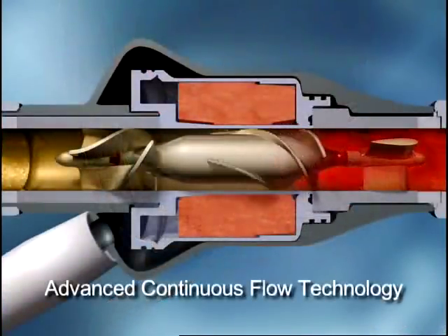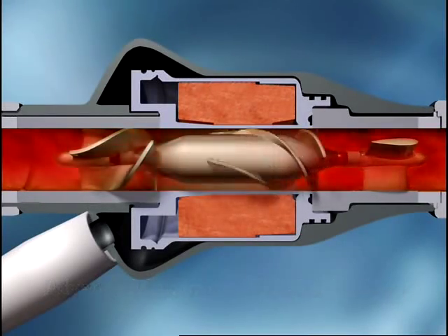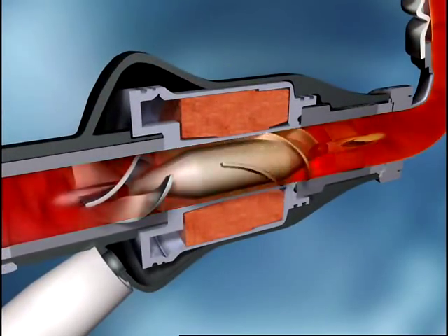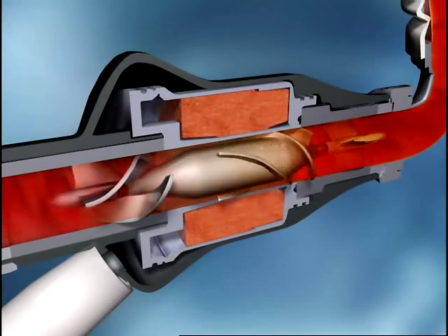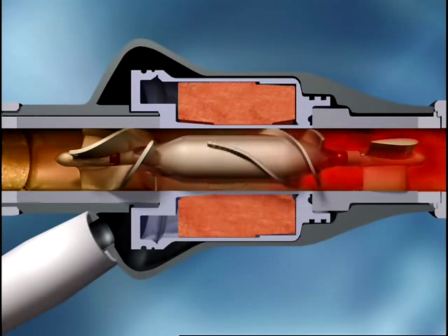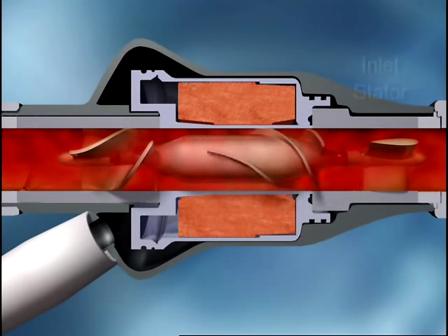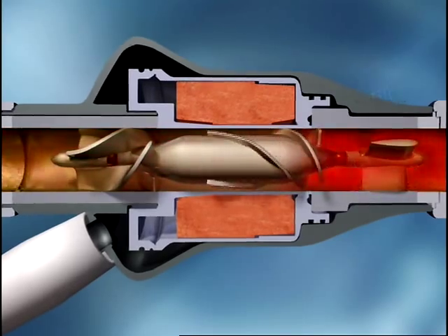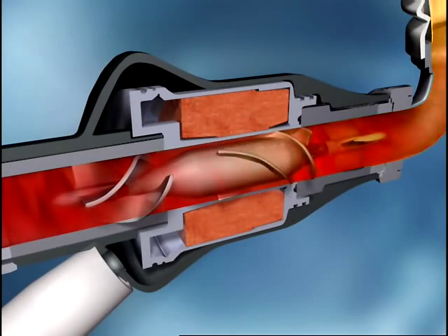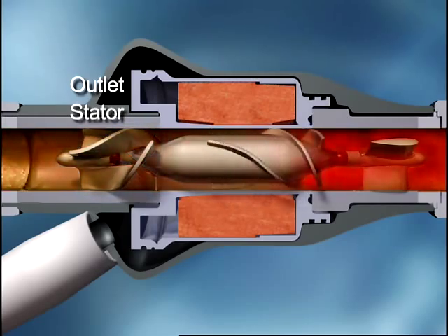Utilizing advanced continuous flow technology, the HeartMate 2 has only one moving part — a small spinning rotor capable of providing flow from 3 to 10 liters per minute, covering the full cardiac output of a healthy heart. As blood enters the pump, seen here in slow motion, it is straightened by the inlet stator vanes prior to entering the path of the rotor. The rotor then spins the blood radially and propels it toward the outlet, where blood flow is straightened by the outlet stator vanes.